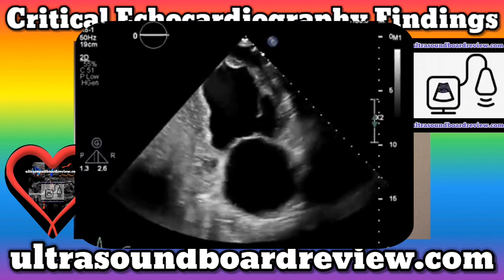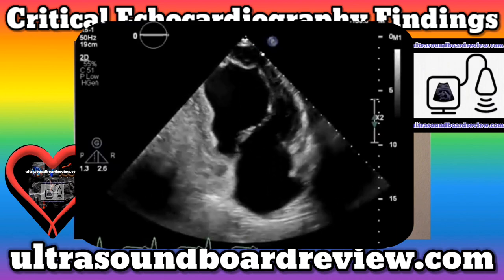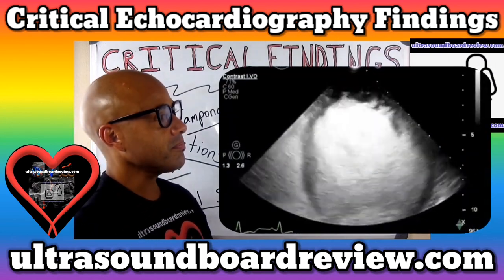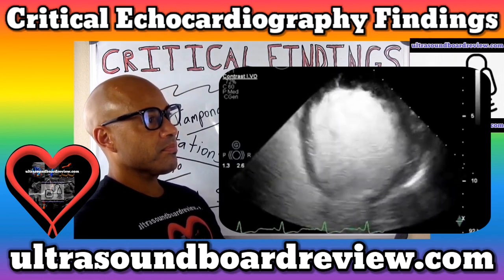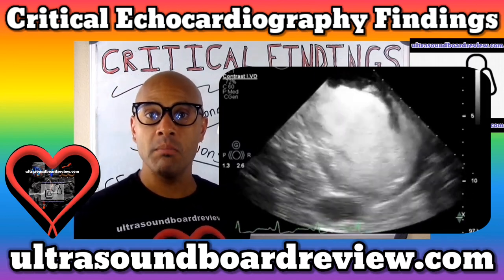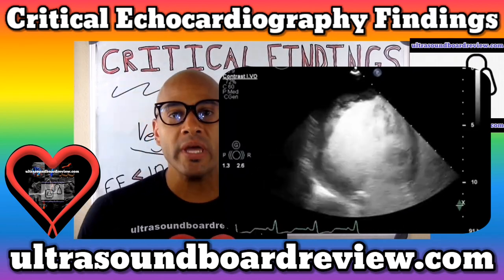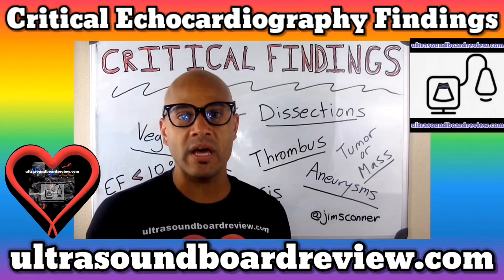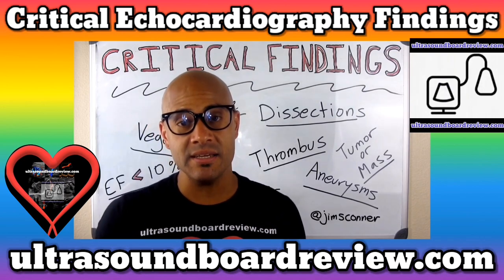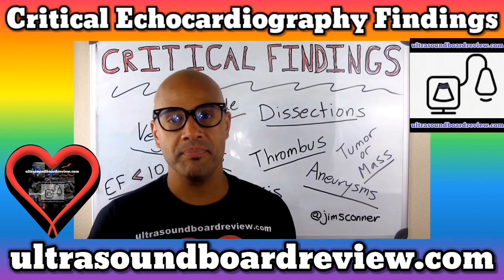Looks like the chambers are all dilated and the right ventricular systolic function is also reduced. Let me show you some images with Definity. Looks like we got something here. Sure enough, this patient was reported to have multiple thrombi in the apex of their heart, and the patient was then put on blood thinners. If you're doing an echo and you can't prove with 100% certainty that there is no thrombus, just go grab something that will enhance the red blood cells. When the apex is out, Definity out — that should be your motto, unless you use Optison.